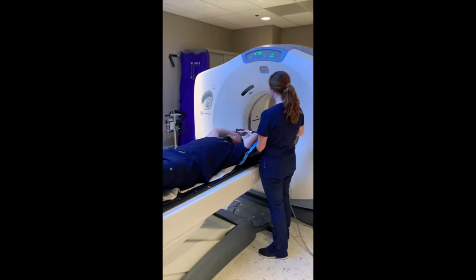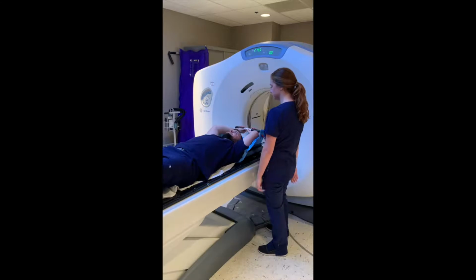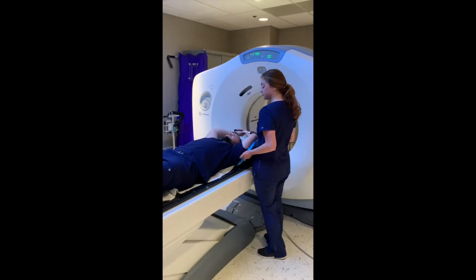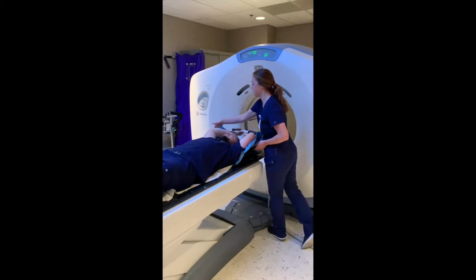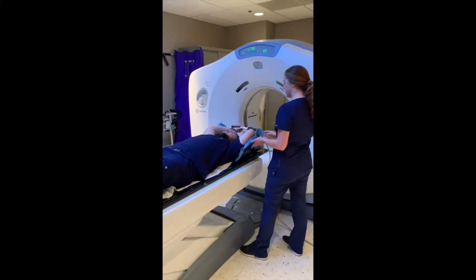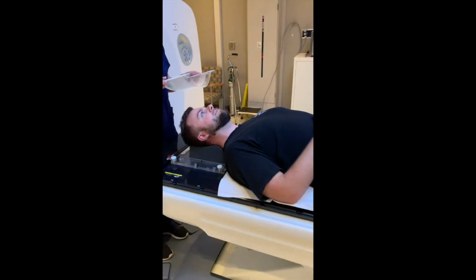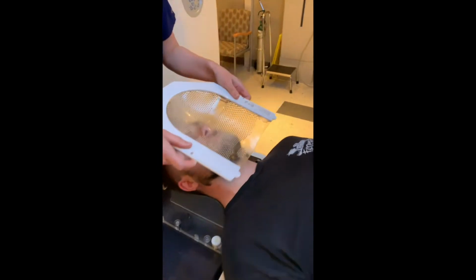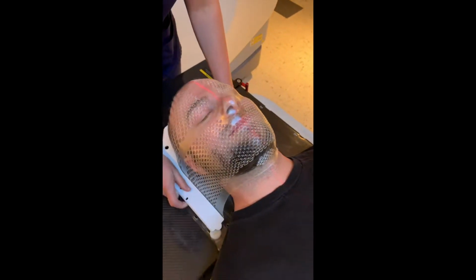Your treatment position will depend on the area of the body that we are planning on treating, and may use a variety of devices that will help us position you for treatment. Some devices, such as a VacLock, will hold its shape to the position we form around you so that we can ensure you are set up the same every day. Other devices, such as a mask, will be heated up and formed around your head in order to hold that position throughout the entire length of treatment.